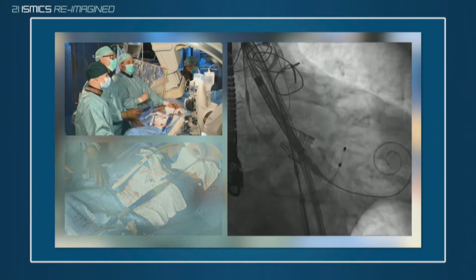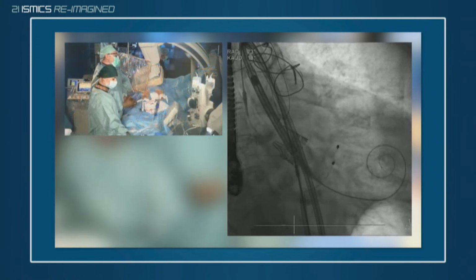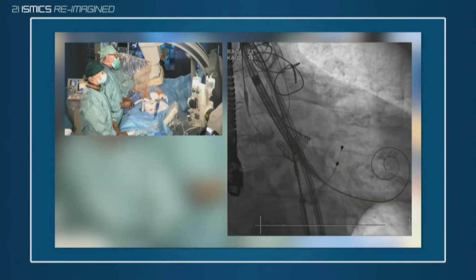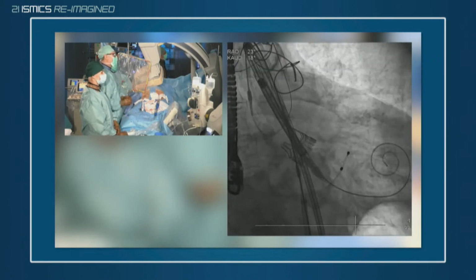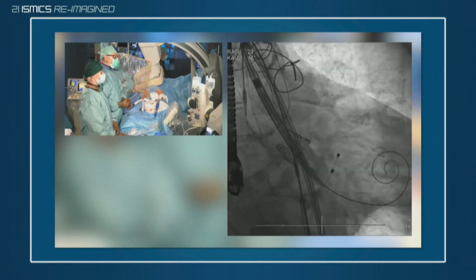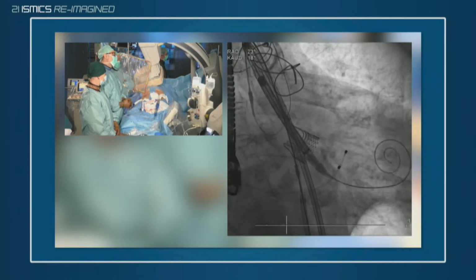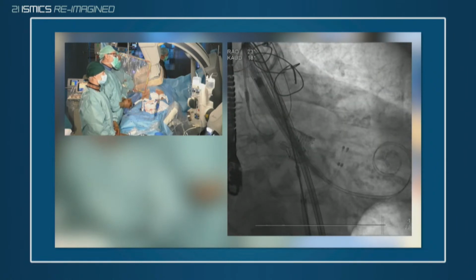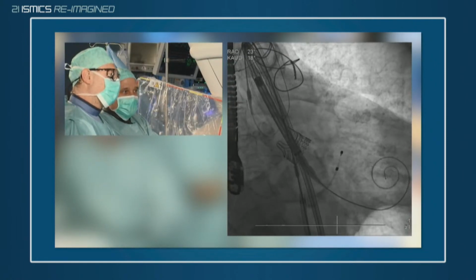The head marker is in a correct orientation, right? So where are we going to aim for the height of the valve? Where do you want to end up with the frame end? When we look at the Intuity design, the leaflets are mounted inside of the upper part of the stent frame. So I think we should end up with the lowest part of the Evolut inside of the lower stent, so in the middle part of the lower stent.